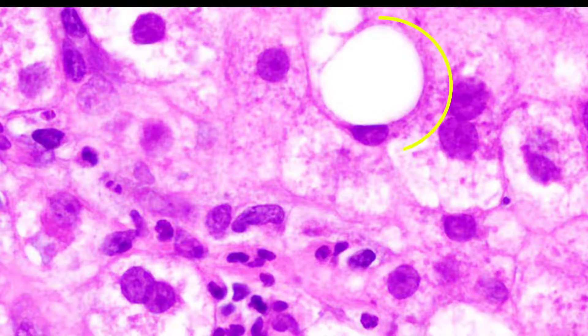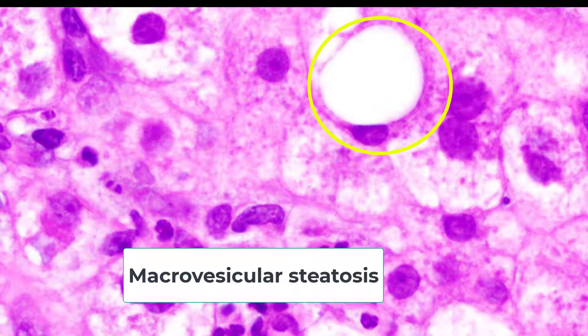The closest mimic of a balloon cell is a cell containing fat, or macrovesicular steatosis. These cells are enlarged, yes, but they have nuclei that are not centrally located — instead they are squished at the periphery. The cytoplasm is also clear, but there is none of that cytoplasmic condensation that you see in balloon cells, and obviously none of that Mallory hyaline either.